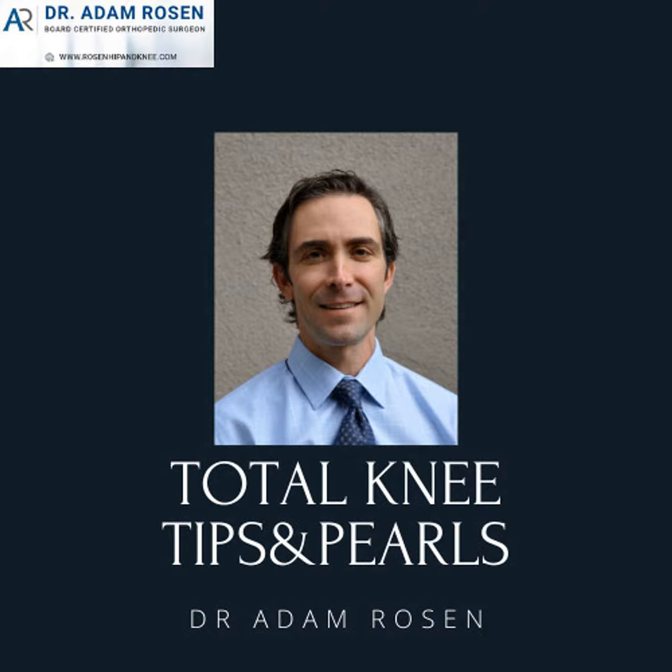And again, you can gloss over it when you get a 70-year-old with a hip fracture that she's skeletally mature. You could skip over that. No one's going to say anything. But if you have that in your thought process, when you see the skeletally immature open physeal patient, you do make a comment on it. So that becomes really, really important.